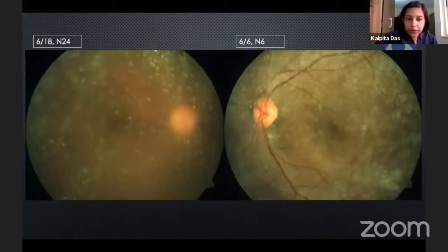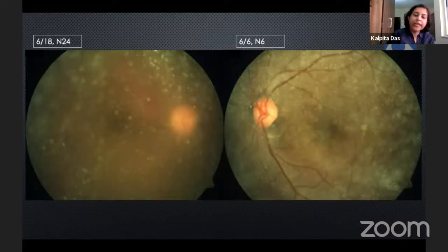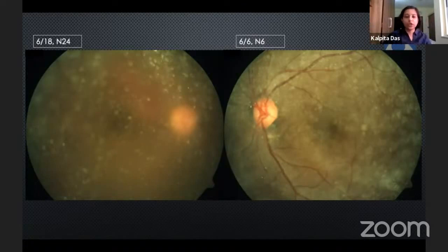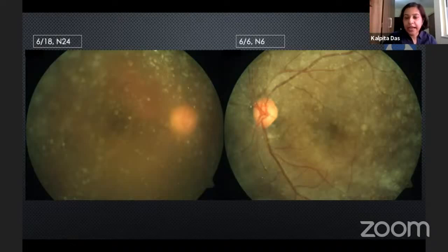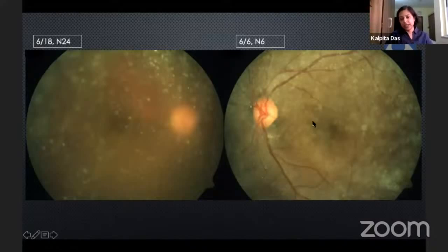The vitreous showed asteroid hyalosis in both eyes. In the fundus photo, we can see the media was hazy, and there was some amount of pre-retinal hemorrhage in the right eye, and detail of the macula was not very well visible. The left eye also had some RPE changes just inferior to the disc, with no other significant findings.